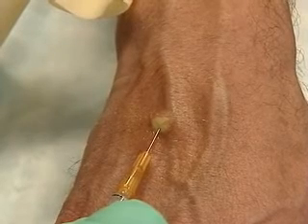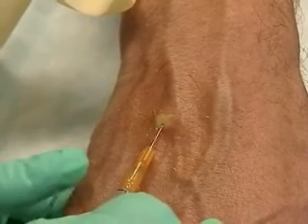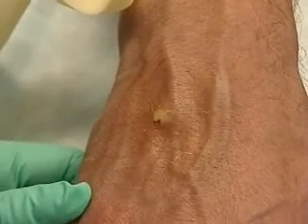As it infiltrates, you'll see a wheal being created, a small protrusion, just enough to numb a small zone around the puncture site.